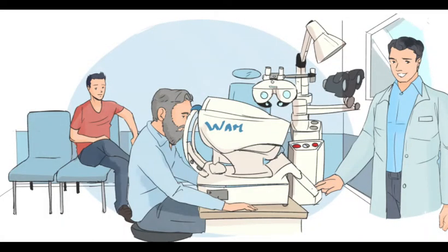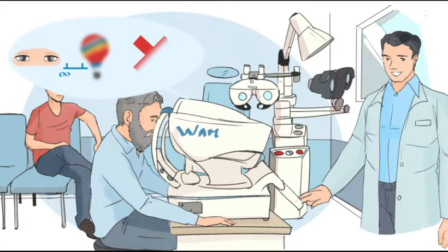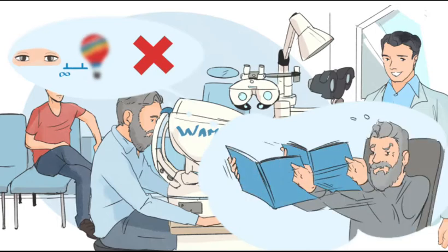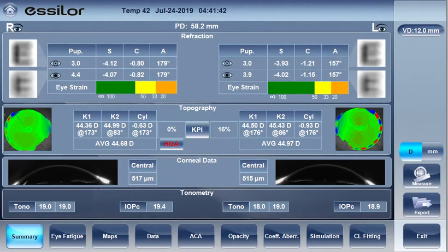What is actually happening on the patient side? The balloon is getting closer in several steps from infinity until the patient cannot provide any more visual effort. At the end of the process, the results are immediately displayed.